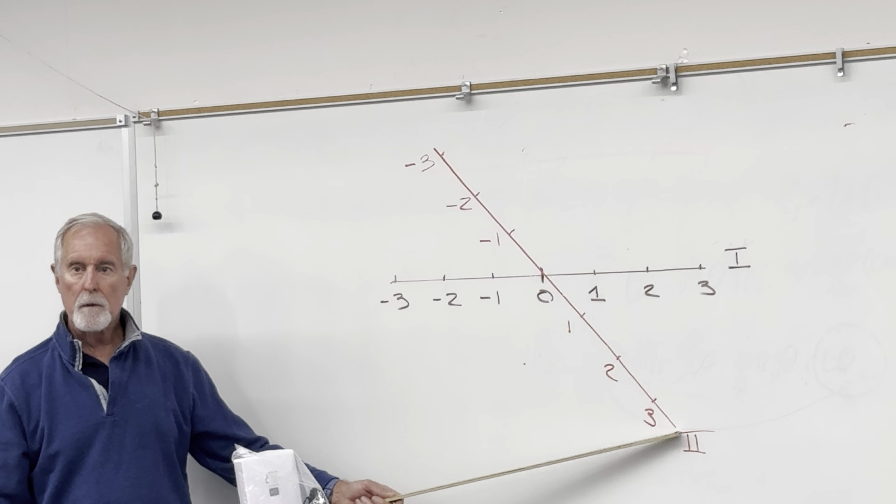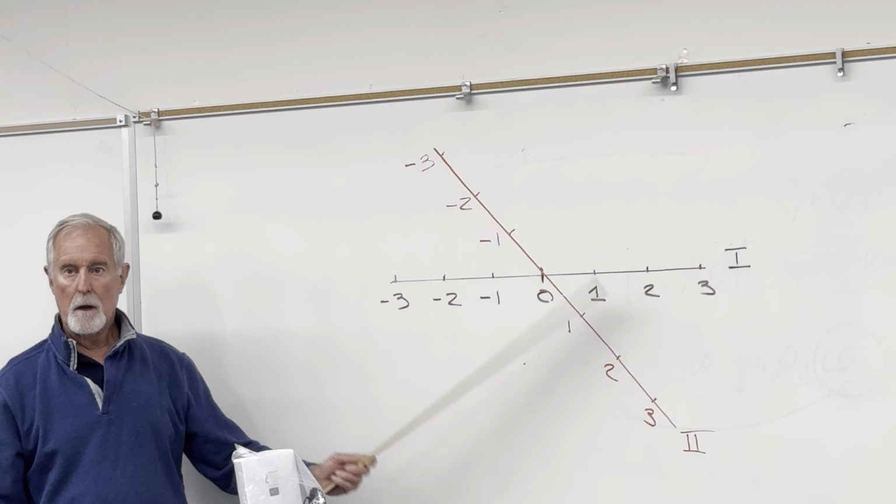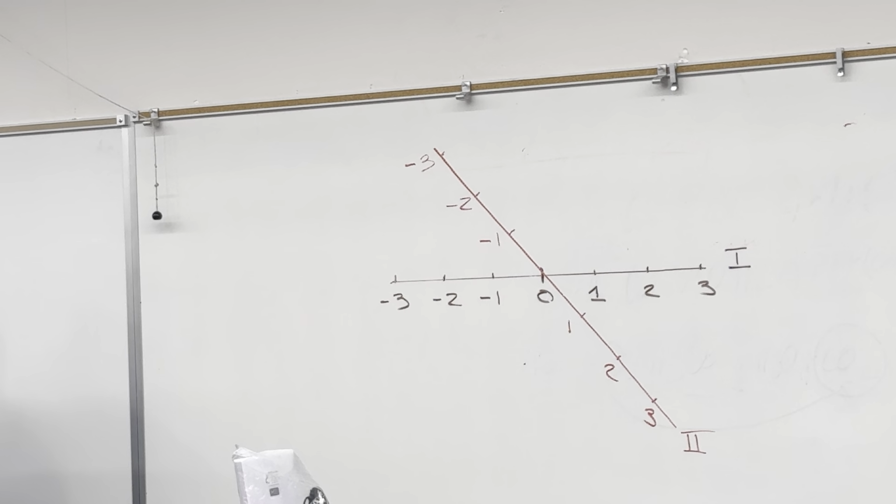Because here's the foot. Here's a positive electrode here, negative electrode here, right? Here's lead 2, positive foot down here, negative electrode in the right arm. Everybody with me on that? If you're confused by that, don't be bashful. Speak up, please. Here's lead 3.